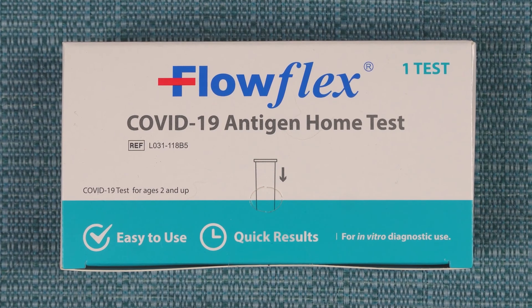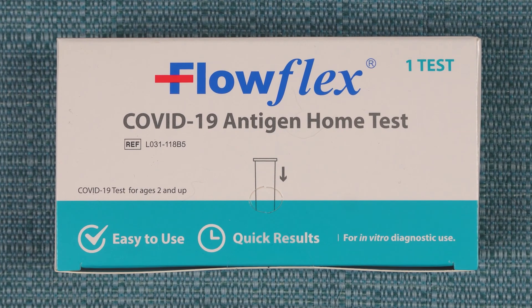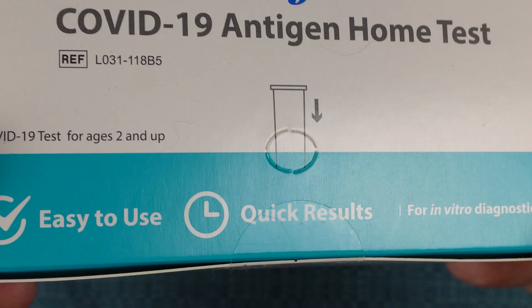I'm about to show you how to administer this FlowFlex COVID-19 antigen test. Open the box carefully, because in a moment you're going to use this perforated hole to hold the testing tube.